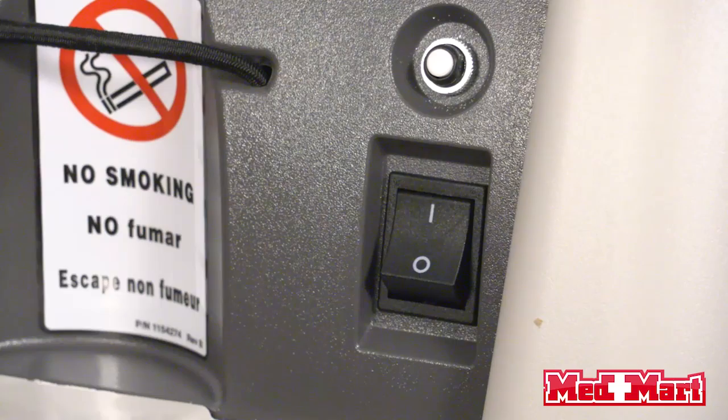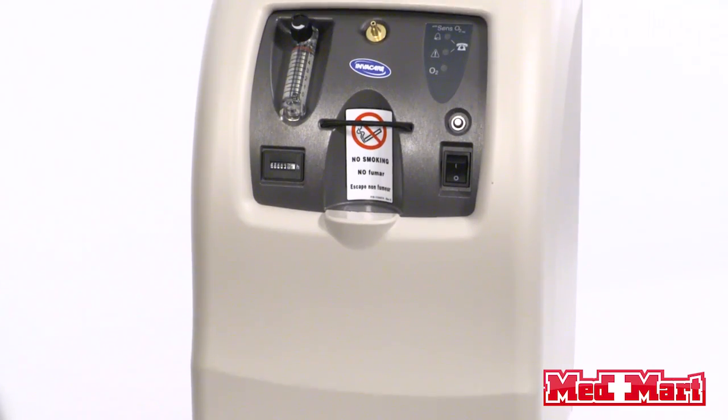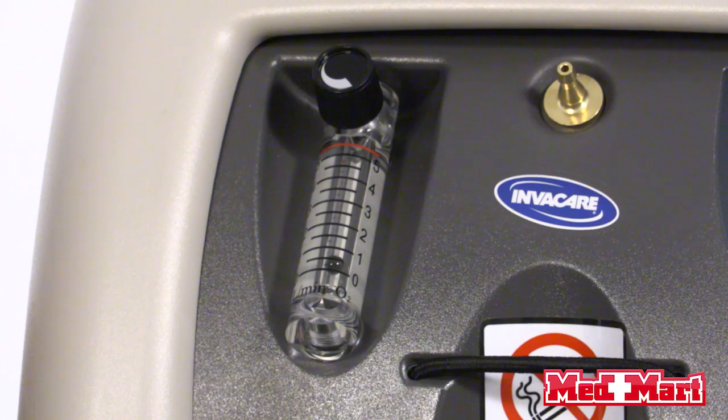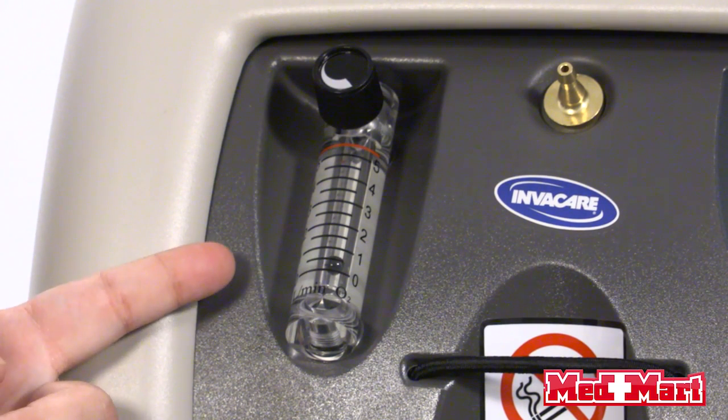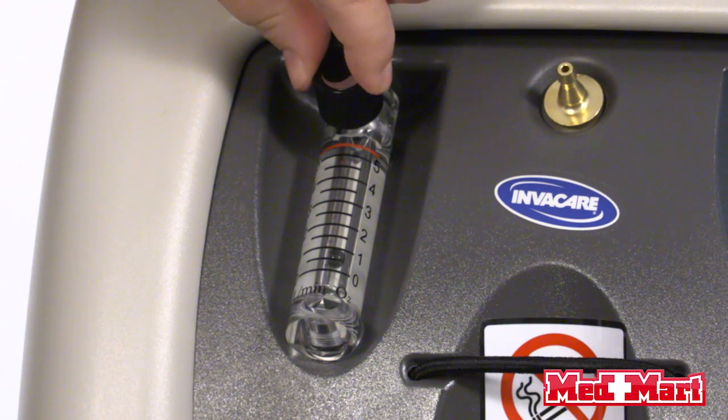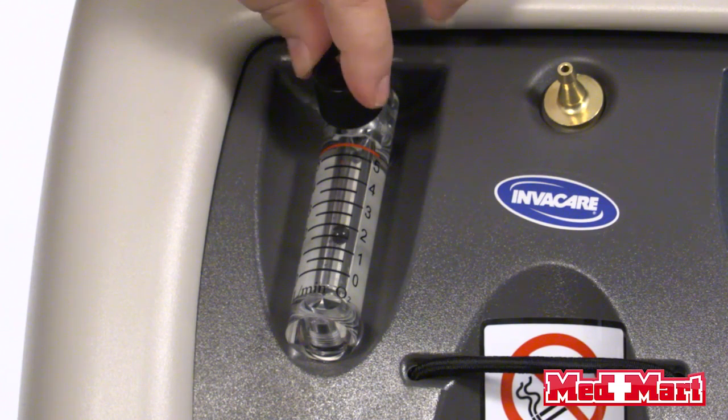Over here on the right-hand side you'll notice your power button. You just click that up and you'll hear an alarm that lets you know your machine is working properly. This machine goes from 0.5 to 5 liters per minute. Right here you'll adjust your flow setting — there is a ball in the middle, and if you turn it down it's going to go to the lower settings; if you turn it up it's going to go to the higher settings.